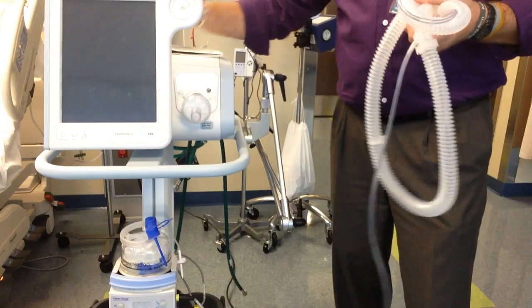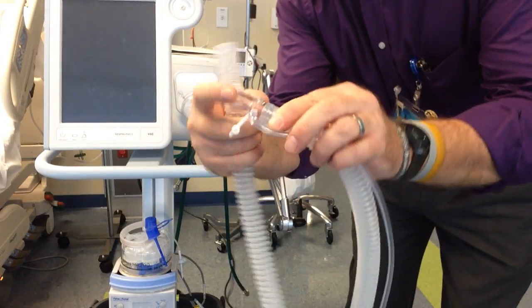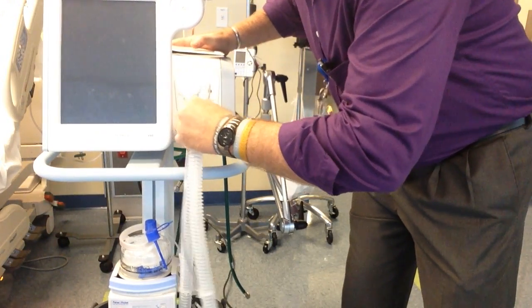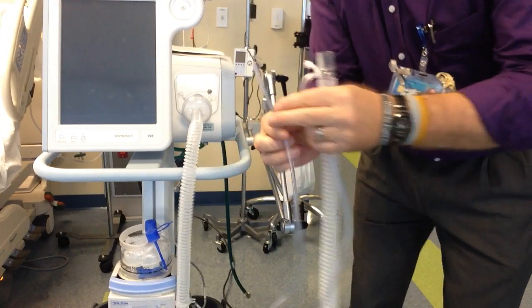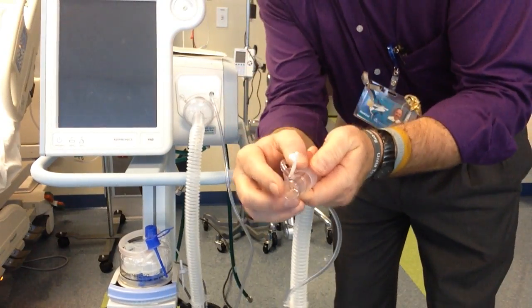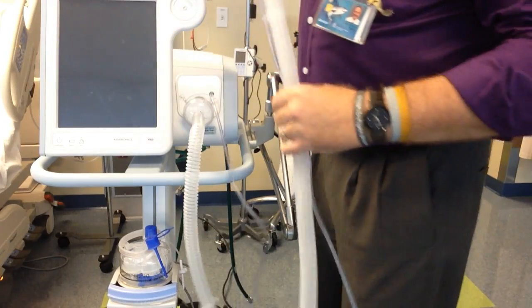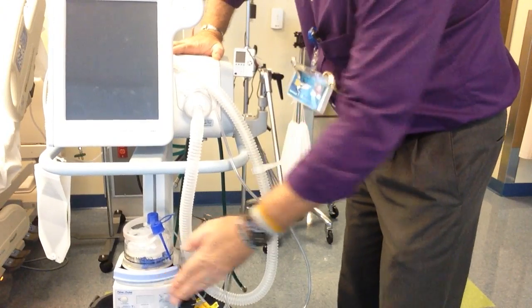Looking at the circuit, you have two ends. This end has the exhalation valve, and it will not fit here. It does not connect. This end does connect. It goes right on. Then you take your pressure line, this one right here, and it only goes one spot, right there. Now this is where you would place your mask. Right now we're not using a mask. For purposes of this, we're going to be using a test lung. Hook it up just like that. That goes over there. Remember, when you're using your heater, turn it on non-invasive.